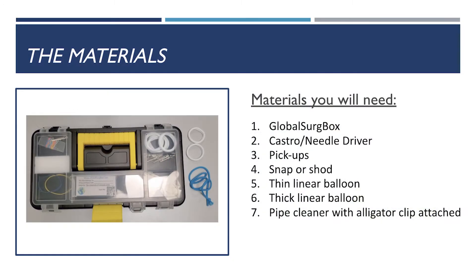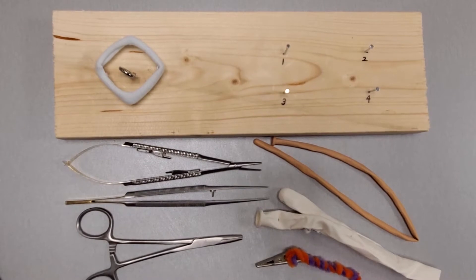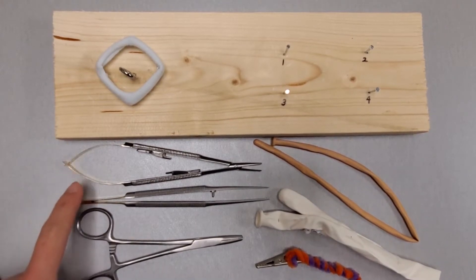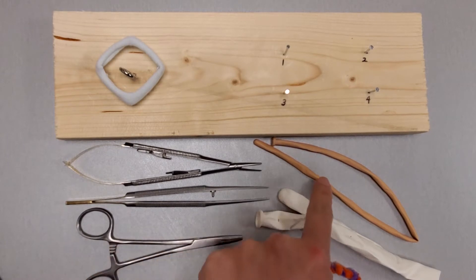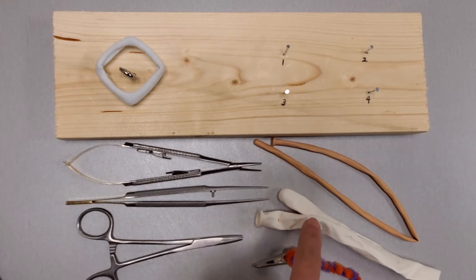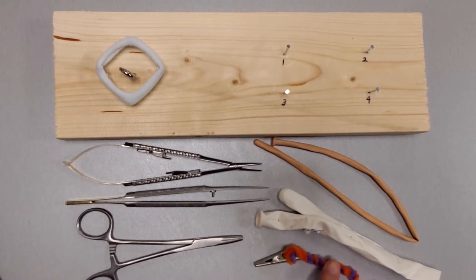Here are the materials that you will need for the vascular end-to-side anastomosis, that's your proximal anastomosis: the board from your Global Surge Box, a Castroviejo or some sort of needle driver, pickups, a snap or shod, a thin linear balloon which is your graft — your saphenous vein — a thick or large linear balloon that will be your aorta, and a pipe cleaner with an alligator clip attached to it.